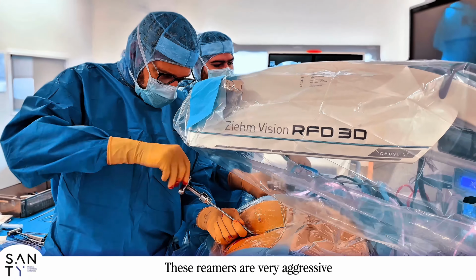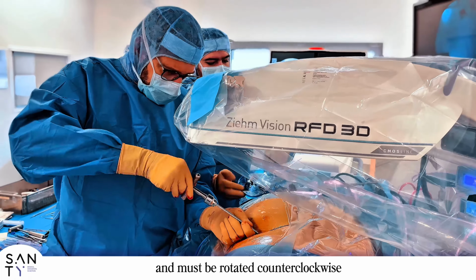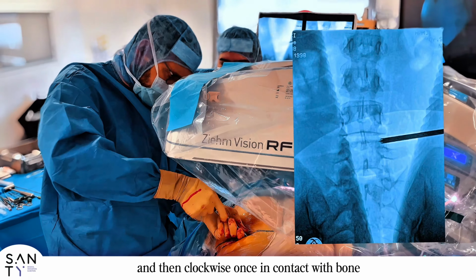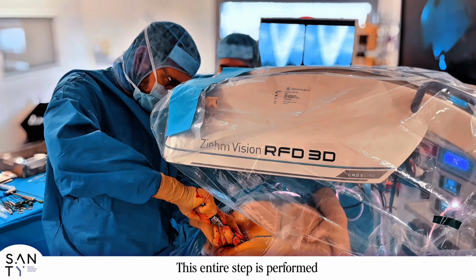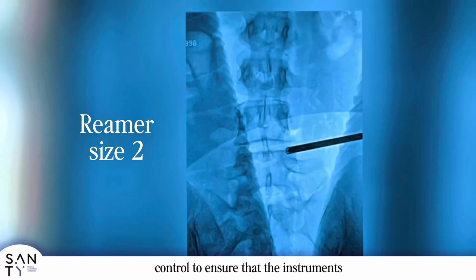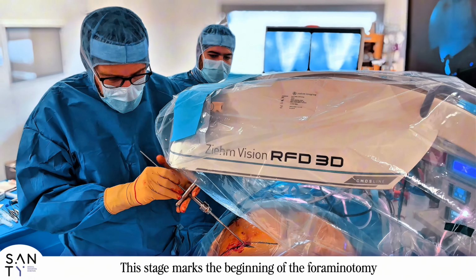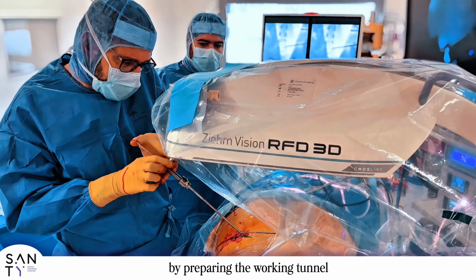These reamers are very aggressive and must be rotated counterclockwise while passing through soft tissues, and then clockwise once in contact with bone. The entire step is performed under strict fluoroscopic control to ensure that the instruments do not enter the spinal canal. This stage marks the beginning of the foraminotomy by preparing the working tunnel.